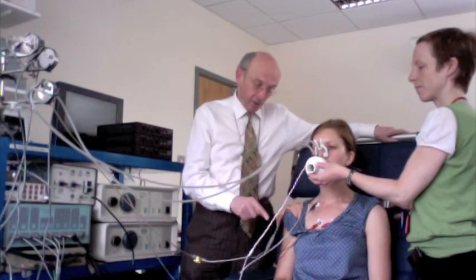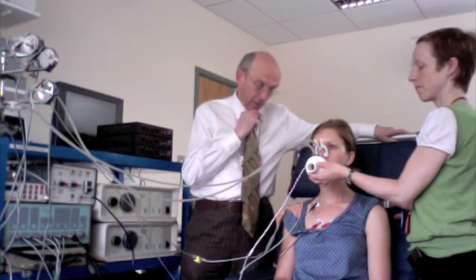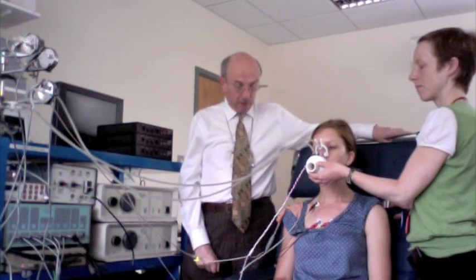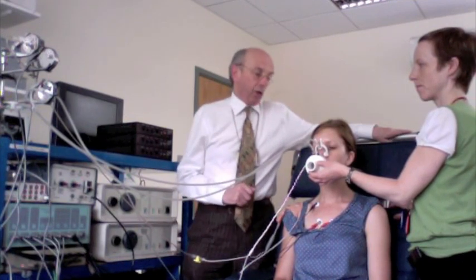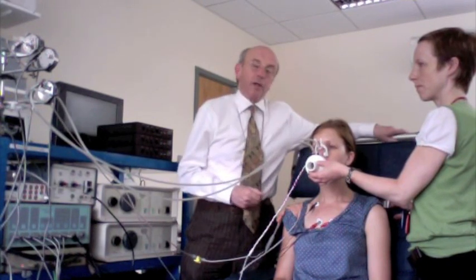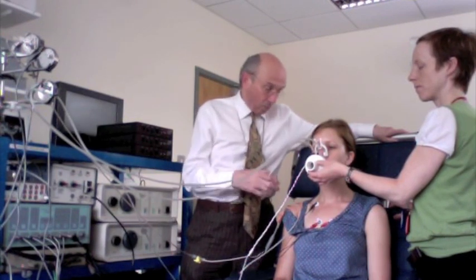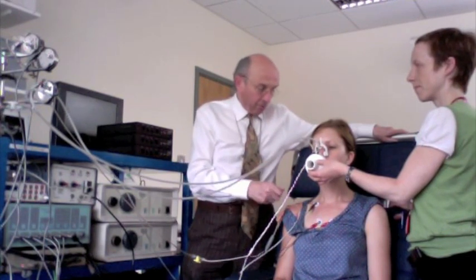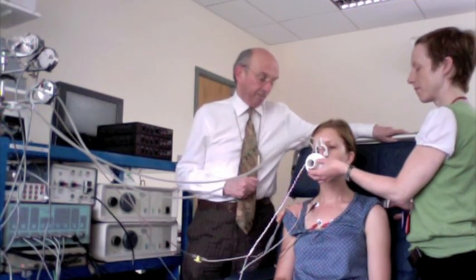And we're also going to measure the pressures. So this catheter has esophageal and gastric pressure measurement capability, and we can measure the transdiaphragmatic pressure. So we're going to do all that during resting breathing. And then we're going to stimulate your breathing, make you breathe more, by entraining carbon dioxide into the system. And we'll see what happens to the drive to these muscles of breathing as you breathe more.